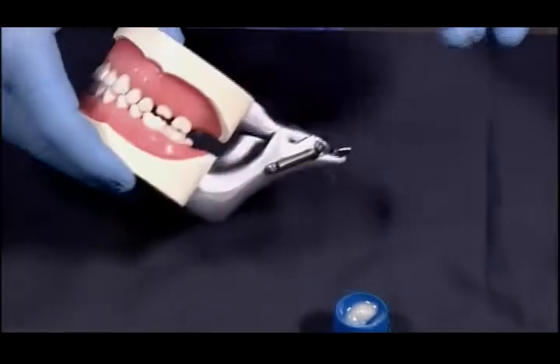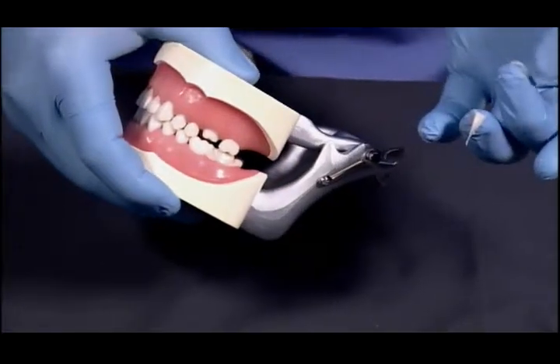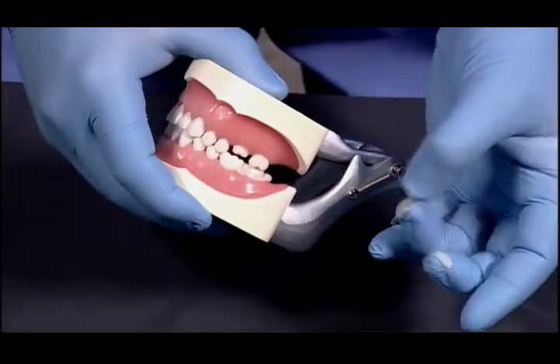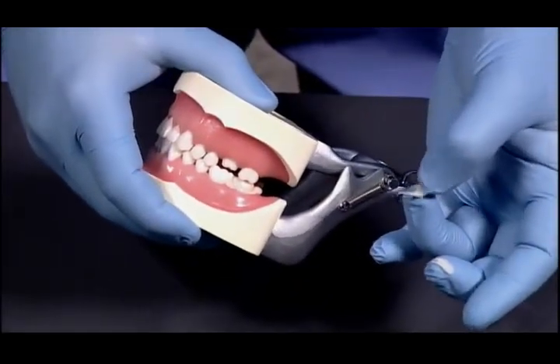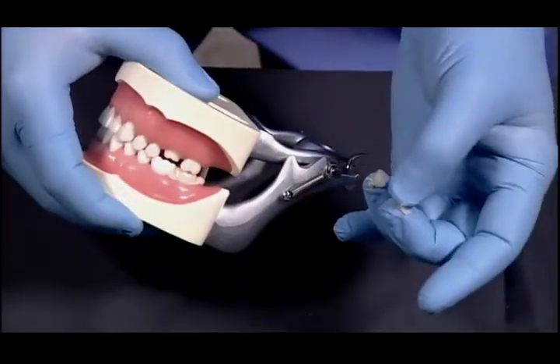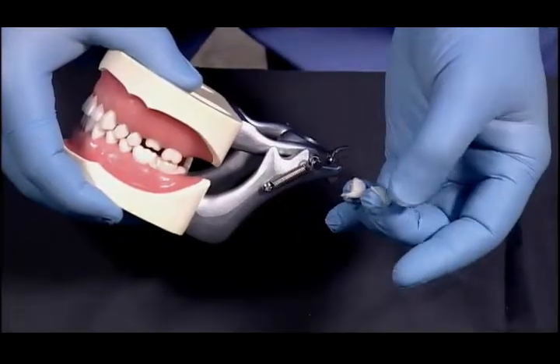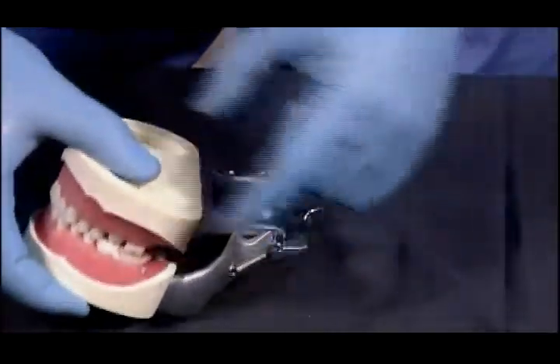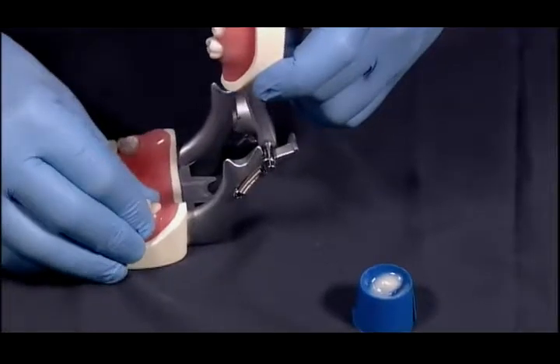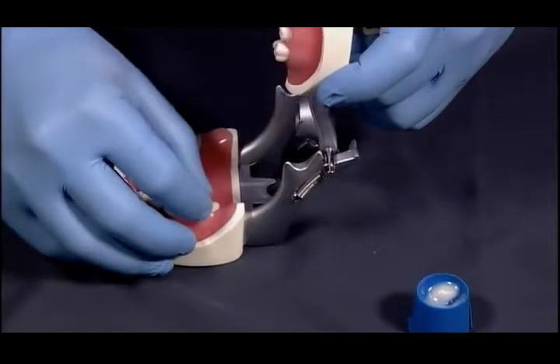the patient bite into full maximum intercuspation, and you're going to be checking the acrylic till it gets into a good solid rubbery stage. And I have some extra on my fingers here that will test it to make sure that it's getting into that rubbery stage. And at that rubbery stage, what we're going to do is remove it from the tooth so that we don't get locked into the interproximal undercuts. There, it's starting to get a fairly good set to it, and I will remove it and then place it back in, and remove it and place it back in.